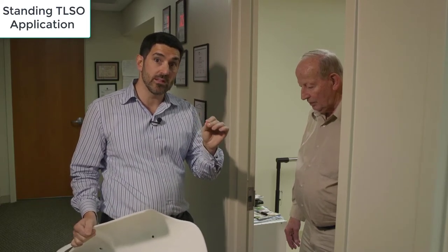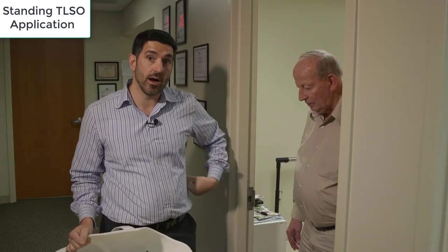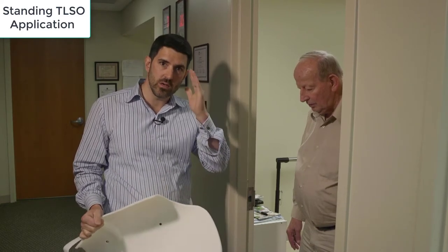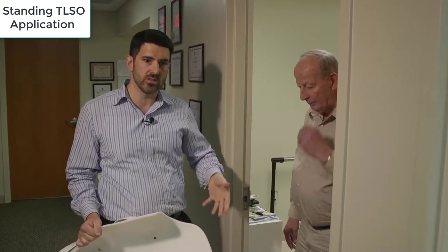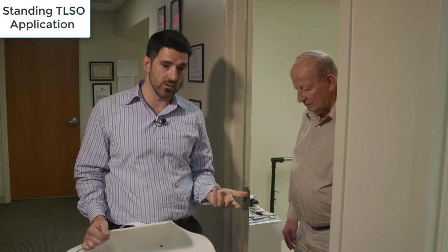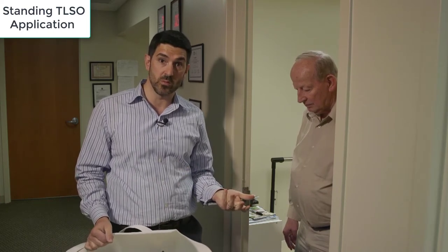The reason we put it there is so it can sit on top of a person's iliac crest, and the patient knows: this is exactly where I place this piece. And if I do the next step correctly, I know I'm wearing my brace right — especially since patients have very little experience with it in the beginning.